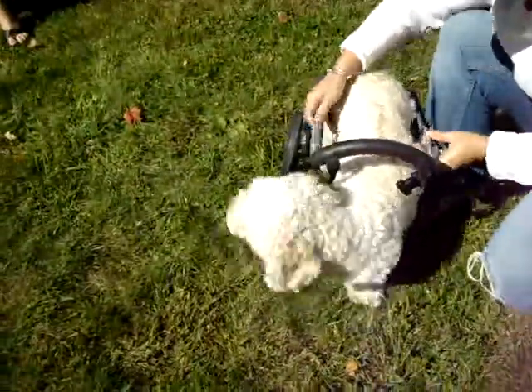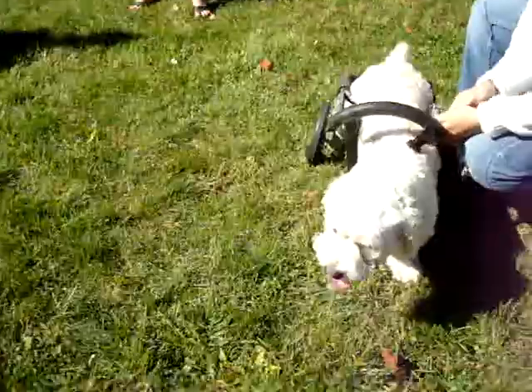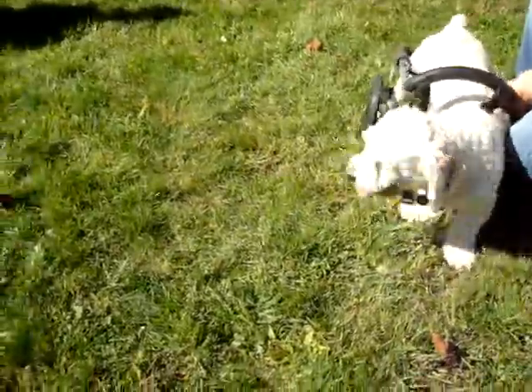Close the yoke. Put the pins in. Stay, honey. Stay, honey. There you go. Watch the tail wag. Okay, good girl.